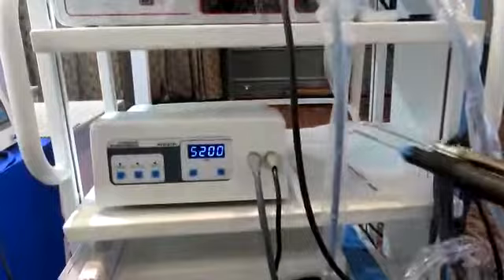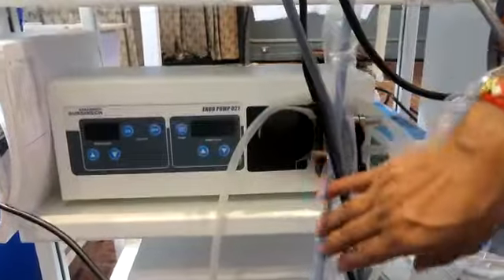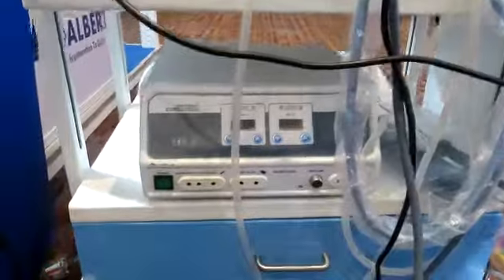This is a suction pump — you can see the endo pump, or arthro pump — and this is an RF machine for shoulder and spine. It's a complete trolley setup.